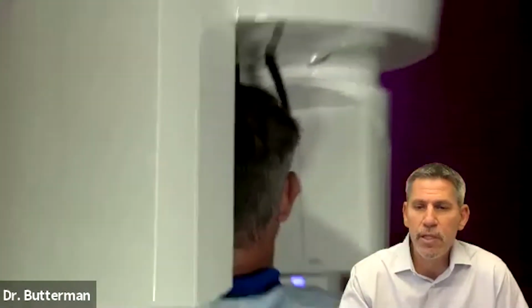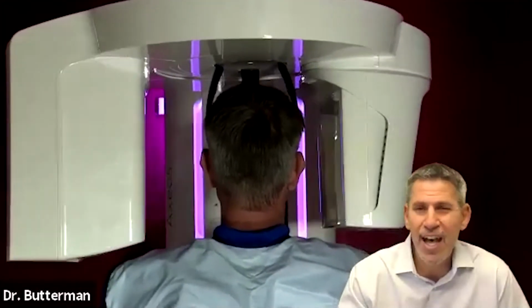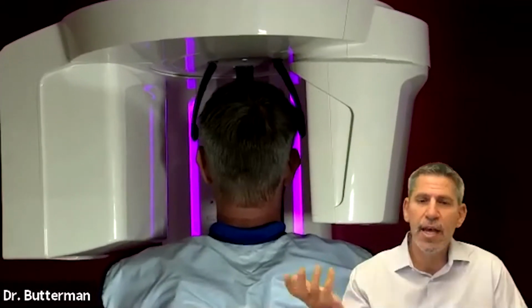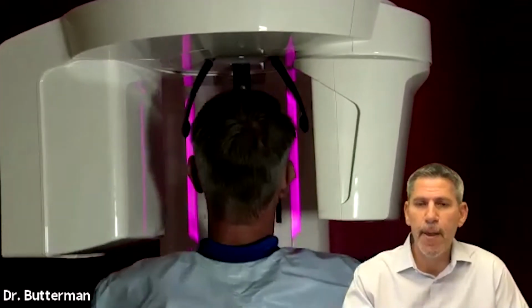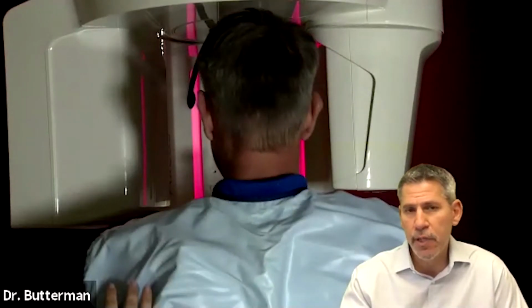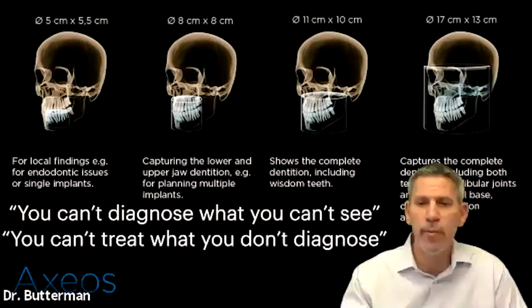And as far as the patients are concerned, it's such a quick scan. This is the highest field of view, highest definition scan, and that's the entire length of time for the scan. So they really don't have to hold still. And that's important because with some of the other scanners out there, the patient has to hold still for quite a long period of time, and that can lead to poor images because of movement.